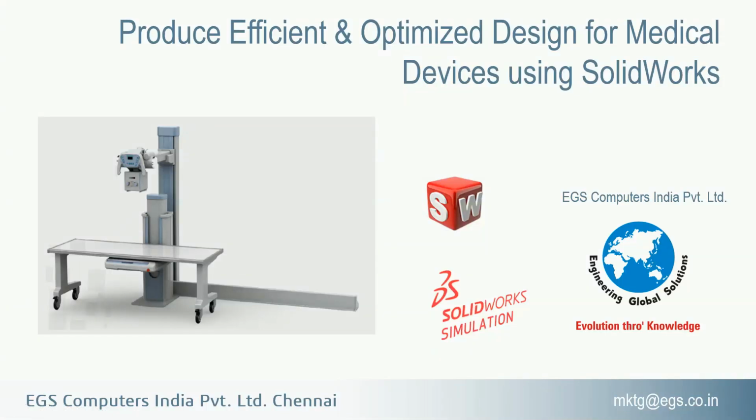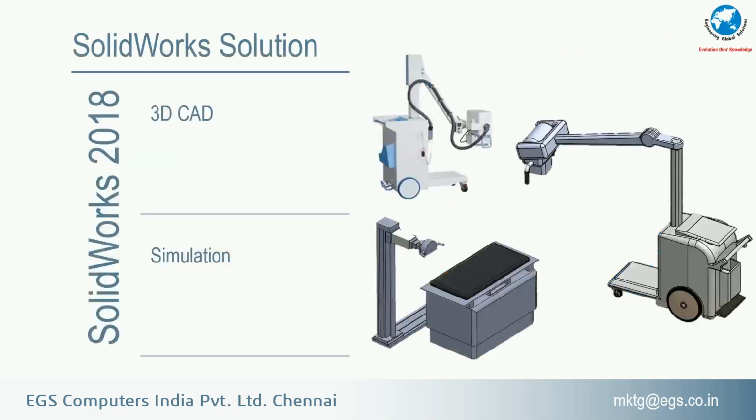In this session, we are going to see how to produce efficient and optimized design for medical devices using SOLIDWORKS. Through SOLIDWORKS, we can design a 3D model of a medical device and do a virtual validation of the design. Here we have designed a sample model of an X-ray machine, which you can see here.